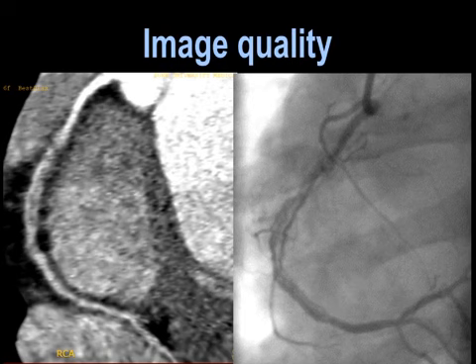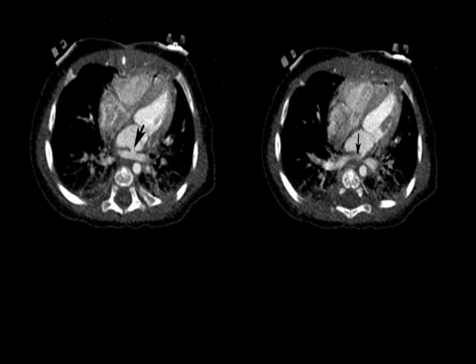And there were some areas of stenosis and irregularity here that were seen on the catheterization as well. But now we're able to follow this child using a gated cardiac study rather than using catheterization, which has its own risks. And this is a fairly low-dose study done on a dual source CT without the need to beta block. Here's some other examples.